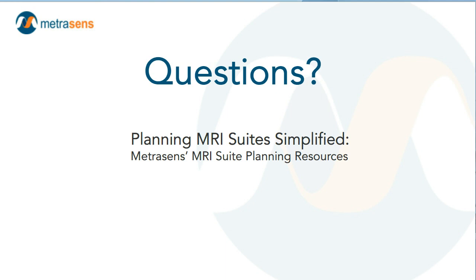You don't have to make access to the system component room come through the MRI suite. You can do it outside.